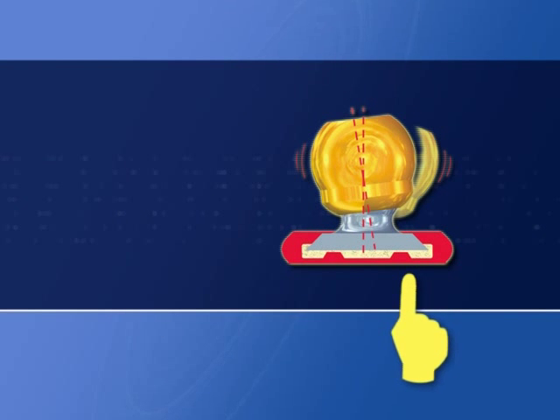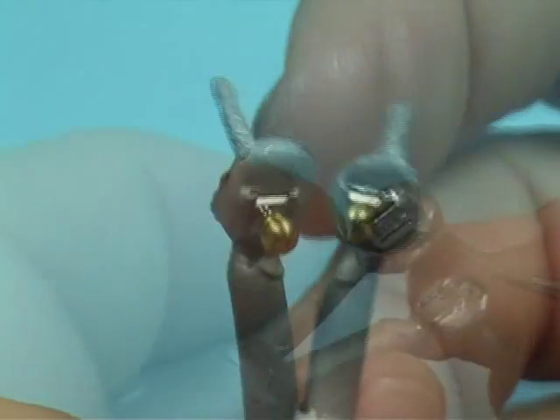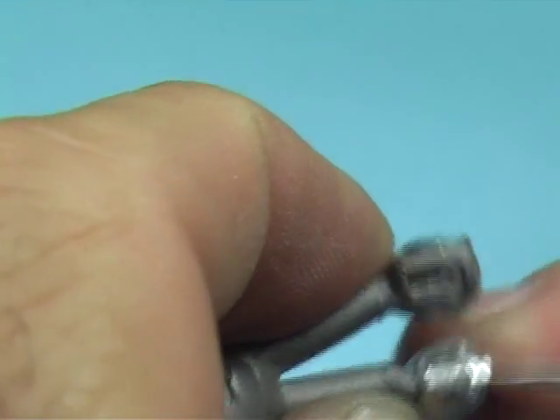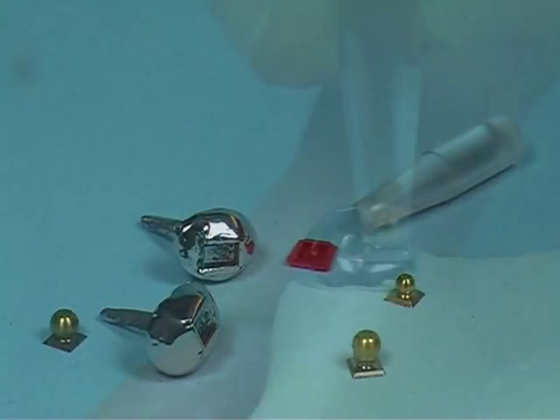It's possible to reduce the thickness of the two small tracks shaped into the base, in order to make easier the insertion of the sphere when it slides inside. Refine and polish any area of the cover to obtain better aesthetic results and promote good hygiene.